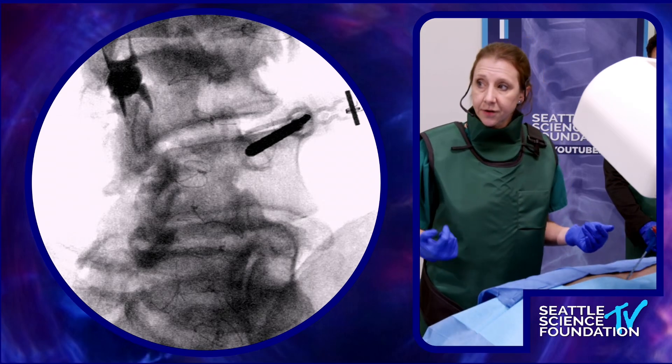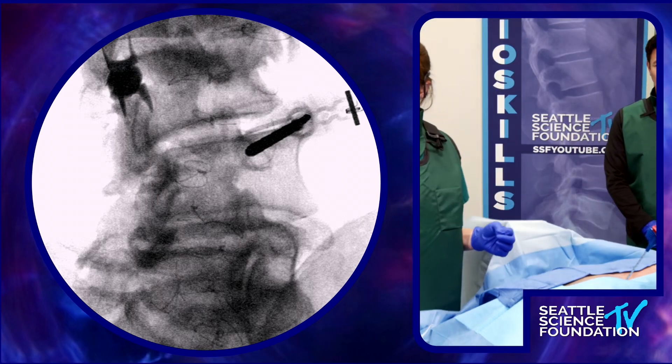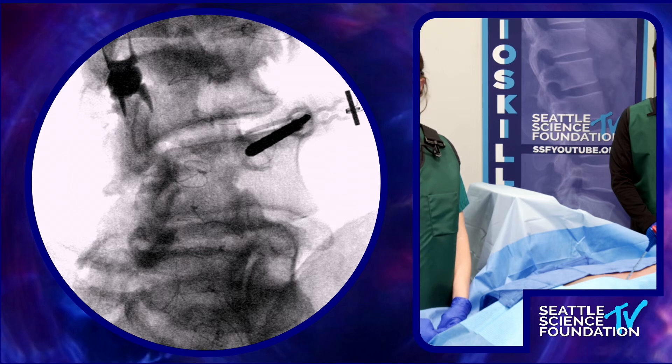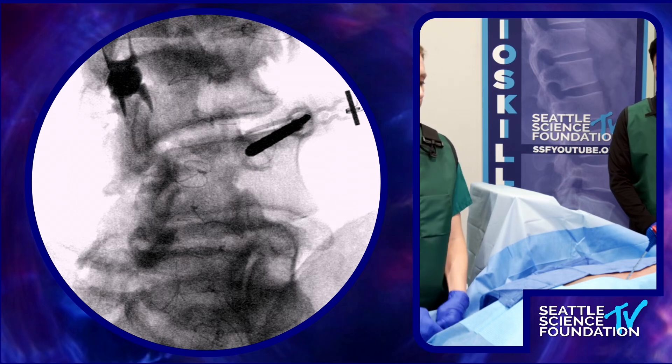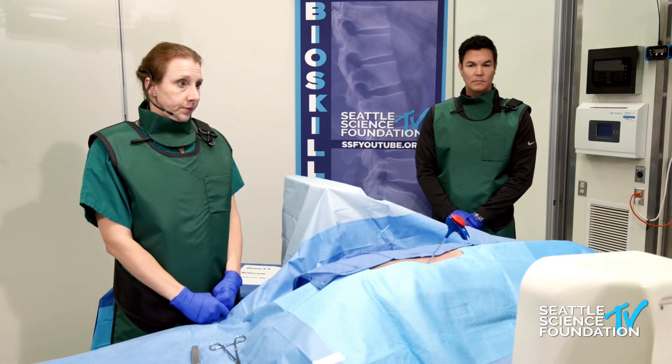I'm going to take a lateral picture at this point. The purpose of this lateral picture is — as you can see, my introducer is moving toward the medial aspect of the pedicle — and I want to see where I am relative to the AP dimension.